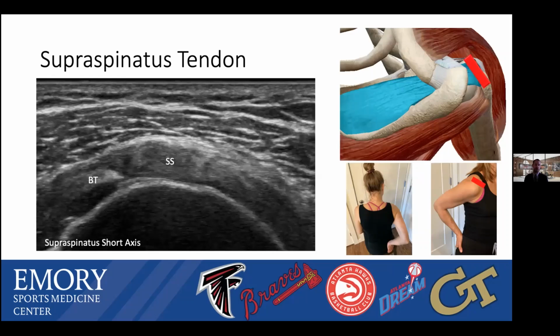And then I'll go into short axis of the supraspinatus, and it's important to evaluate the most anterior aspect of the supraspinatus. You know you're doing this by getting the bicep tendon within view, and then you're looking for tearing. You could also look for any cortical irregularity that might be an indirect sign of a tear, or cartilage interface sign as well, which were not present for the supraspinatus.